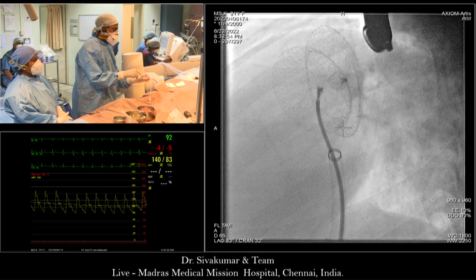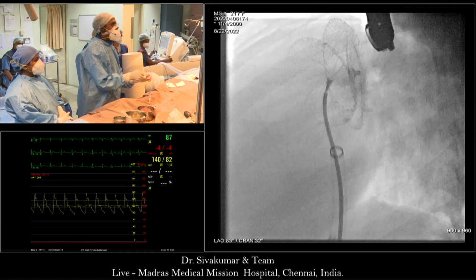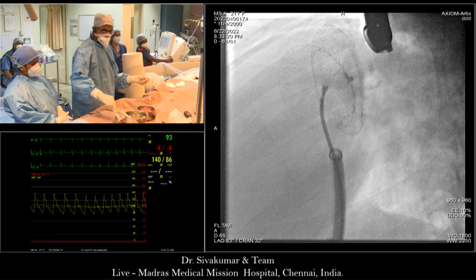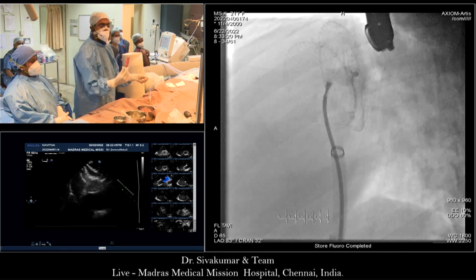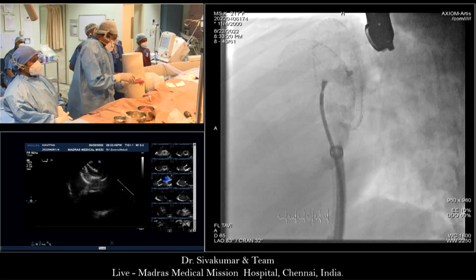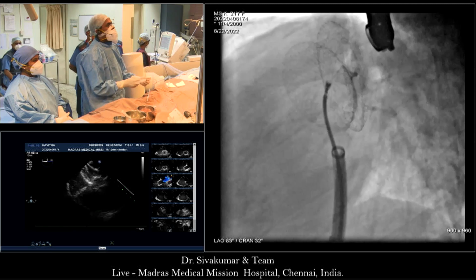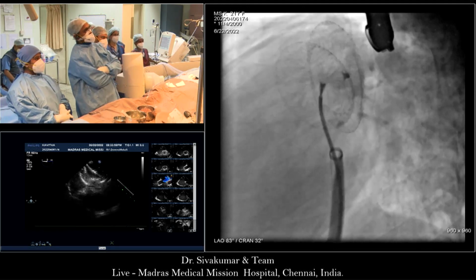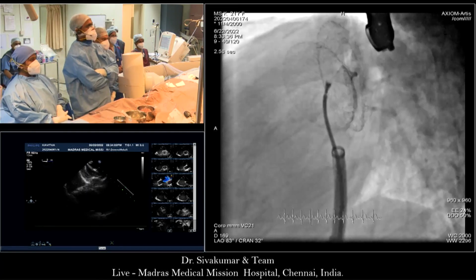In the audience, Srija, let's get a show of hands: those who are happy with the device and the mitral valve. Okay, so a couple of people are happy. Who is not happy? The whole audience. Well, I think it's 99%, because you coaxed them into saying they're not happy. Yes, the concern I still have is the angulation of the device pointing towards the left atrium. It might impinge, but it might not, and it's close to the mitral valve.